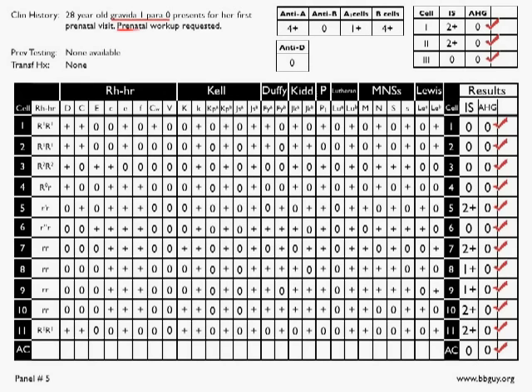You notice these reactions are not opposites of each other. You have a positive negative on the forward or red cell grouping, and you have a negative positive on the reverse or the serum grouping. And the one that obviously stands out to you is that little 1 plus there under A1 cells. More on that in just a moment.